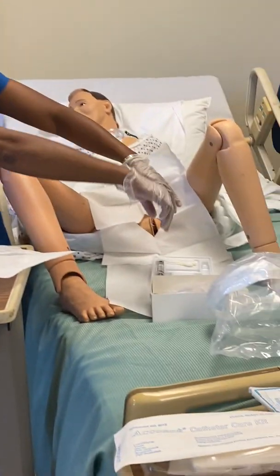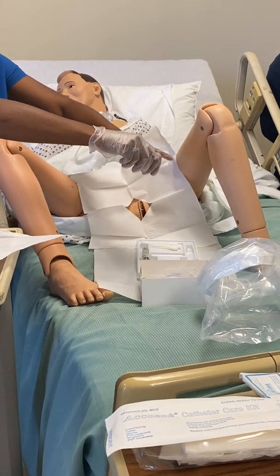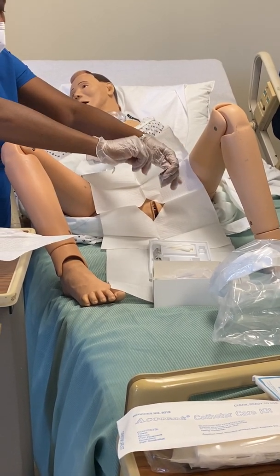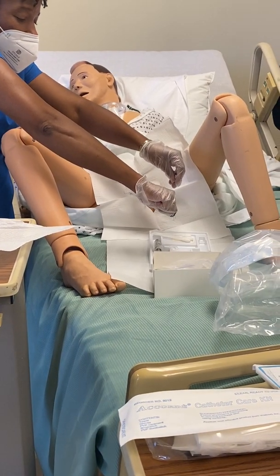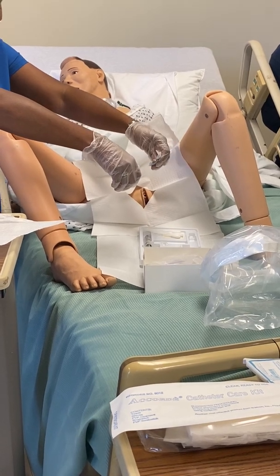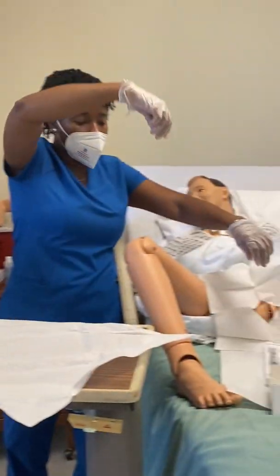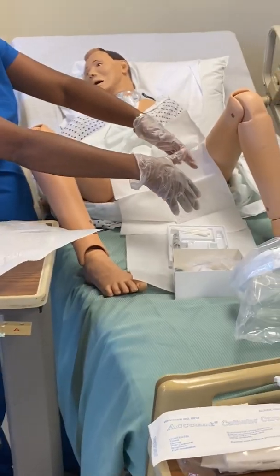Okay? So now I'm going to go through the process of opening my lubricant. Remember, when you're inserting something in something, it needs to be lubricated. And I'm going to put that there. Now, you have the option of sending that lubricant, this empty package, over to the side, or you can come around back and drop. Okay? All right. So I got all of that in there, and next I'm going to test my bulb.